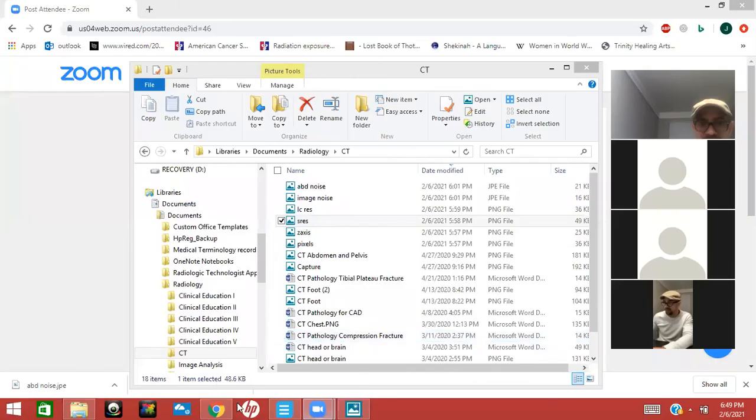There's this image of the abdomen with spatial resolution here. So if that's the case, then why do you have better contrast resolution when the slice gets bigger, if more densities average together? Well, because volume averaging or partial volume averaging is one of the categories under spatial resolution, not contrast resolution. Does that make sense? Yeah. So it's like it averages the pixel color or whatever. Yeah. Let me do this screen share again and see if I can find that.